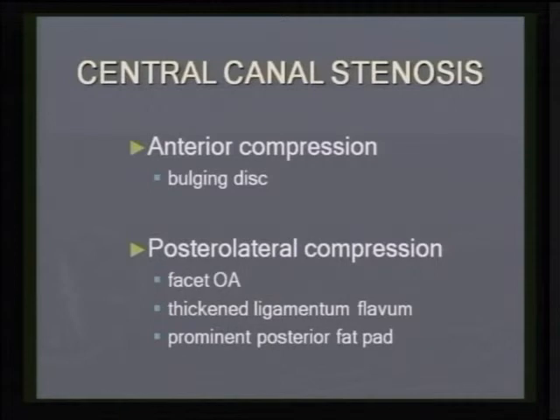As far as central canal stenosis is concerned, the compressive features anteriorly are the bulging disc, and the posterolateral compressive features are facet osteoarthritis with bulky osteophytes, thickening of the ligamentum flavum and prominence of the posterior epidural fat pad.